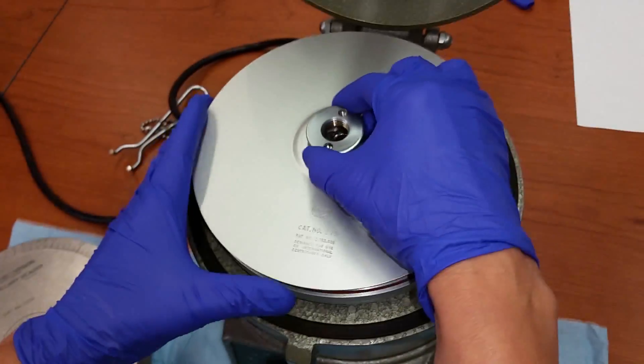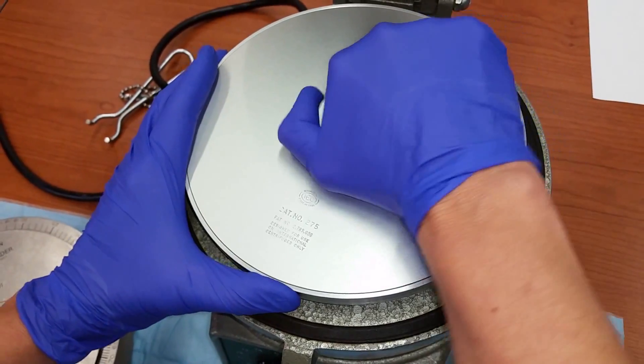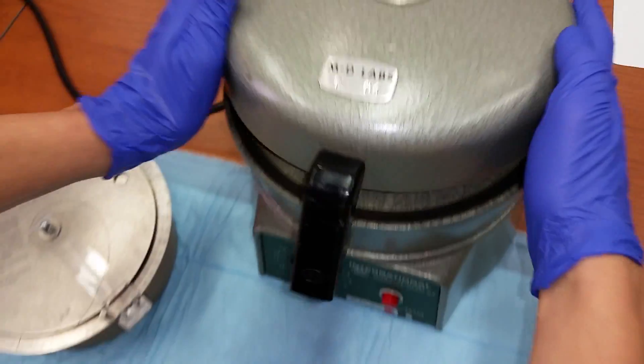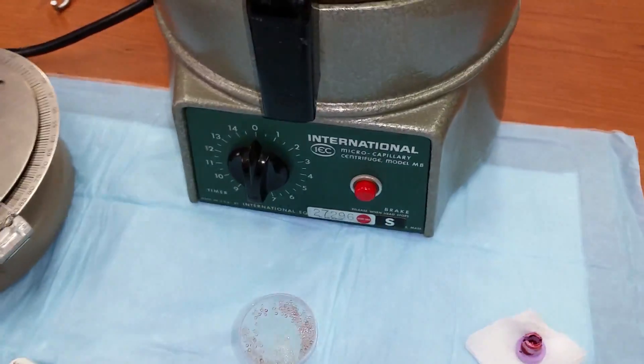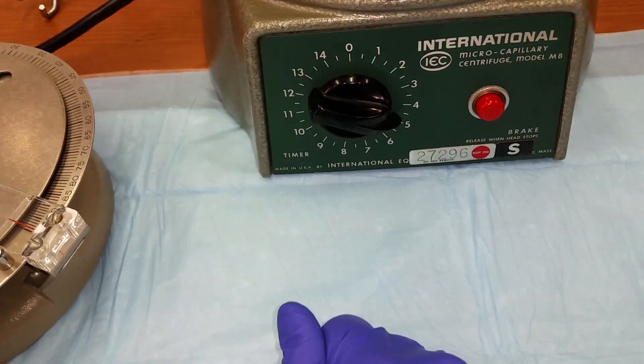Make sure that you close the top of the centrifuge. Otherwise, during spinning, all the tubes will break. Close the top of the centrifuge, lock it, and then spin for approximately five minutes.